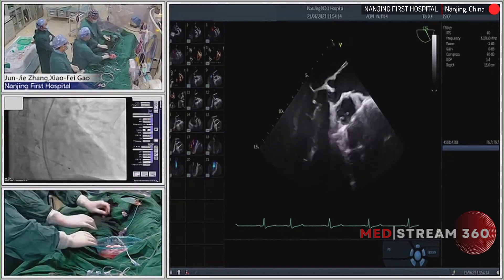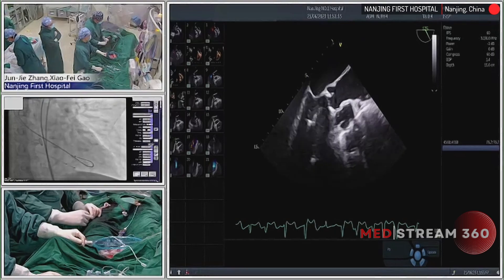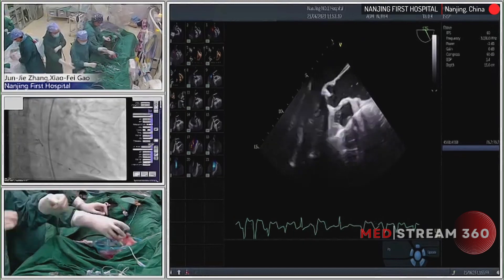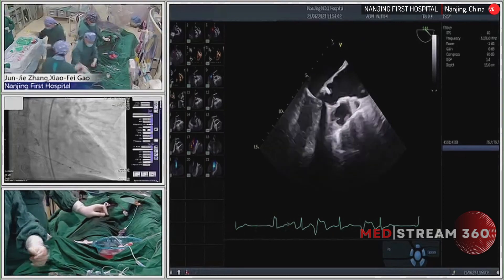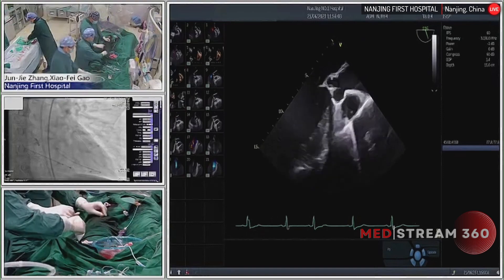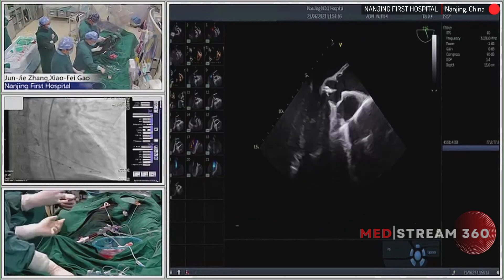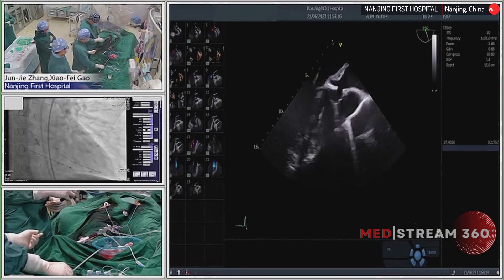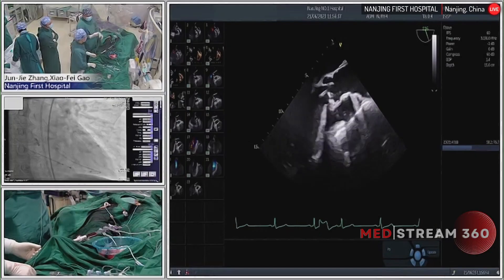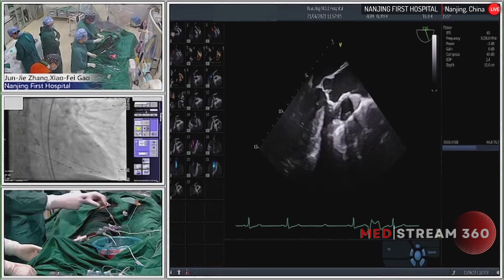The next step is to use a pigtail catheter to exchange the wire. I tried to insert the pigtail into the apex. Echo guidance is quite important here to confirm the wire position. We can confirm it is already in the apex. The LV cavity is very, very small. From the hemodynamic view, we shaped the wire tip with a small curve, considering the small LV dimension.